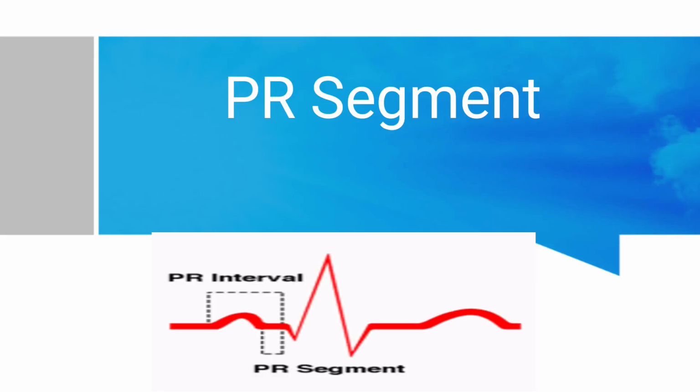Hi friends, in this series of ECG basics, today I will talk about the PR segment.